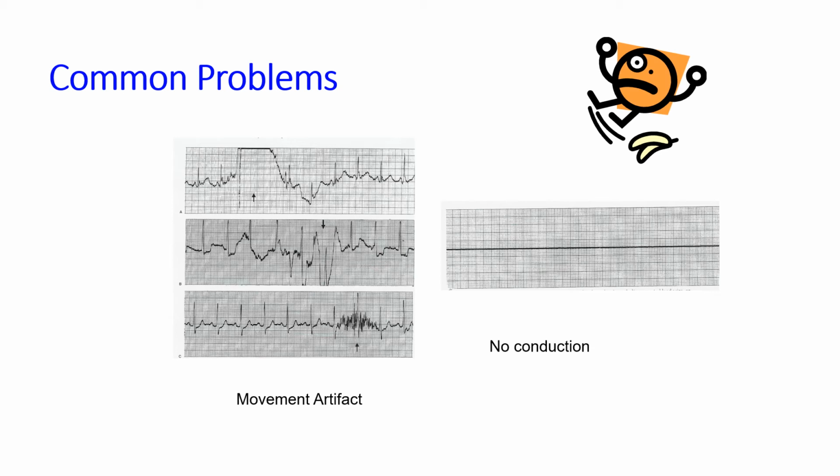But one thing that will help with minimizing artifact is making sure that you put the electrodes on clean, dry skin. Oftentimes, patients could be very sensitive to the electrodes, and you may have to change them daily. And check the center of the electrodes for moisture. If these electrodes have expired, the conductant gel that's in the middle of those electrodes will not conduct well, so therefore they will not pick up well at all and cause more potential for artifact. So it's always important to make sure that the electrodes are not unsealed for a long time or expired.